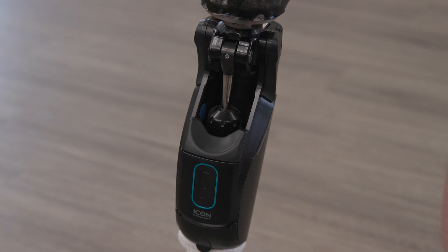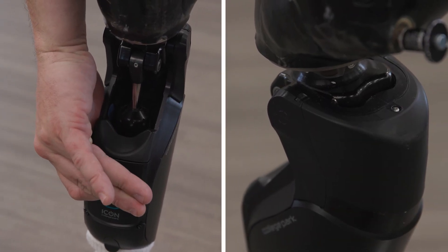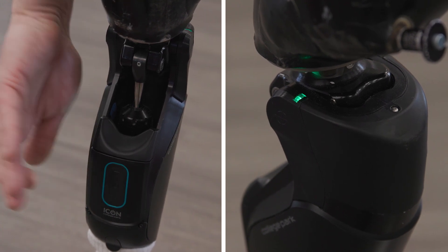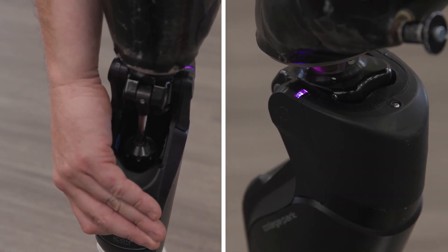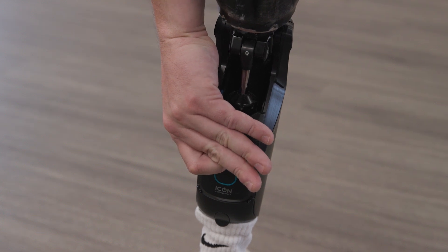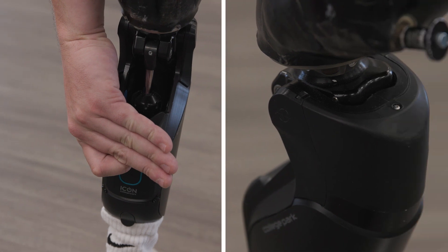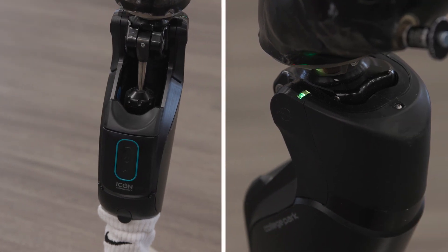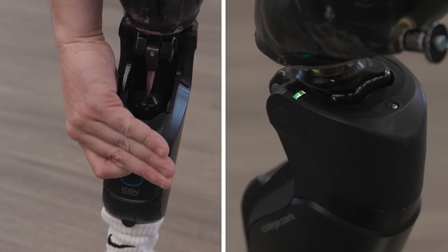The mode can also be changed without using the app by pressing the lock/free swing button on the back of the knee. Press and hold the button for three seconds to engage lock mode. The LED indicator will turn purple while the knee is locked. Press the button for three seconds again and the knee will go back to normal mode. Press and hold the button for six seconds to engage free swing mode. The LED indicator will turn yellow while the knee is in free swing. Press the button for three seconds again and the knee will go back to normal mode.